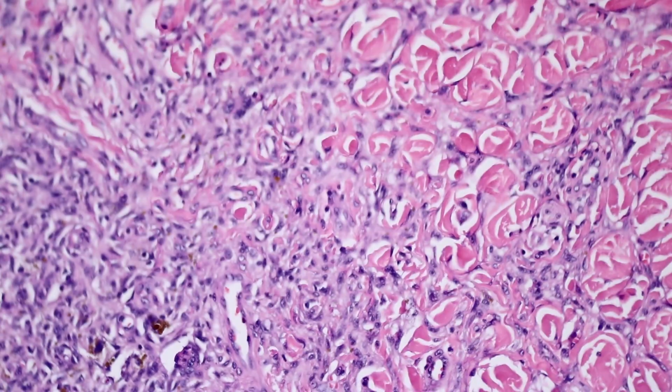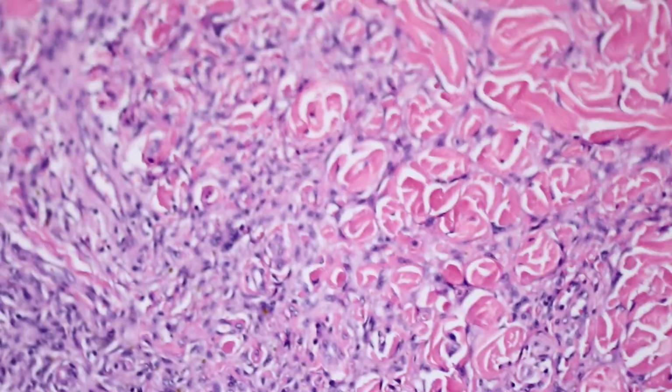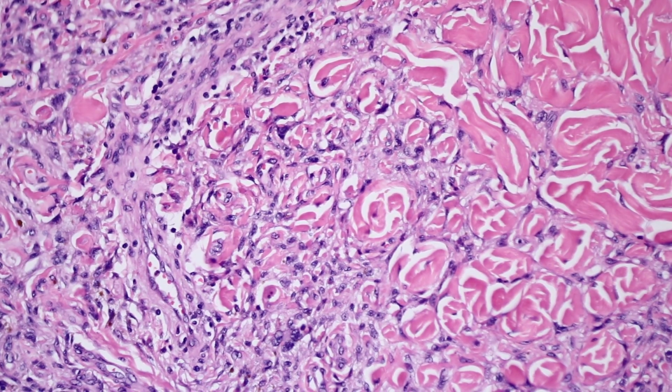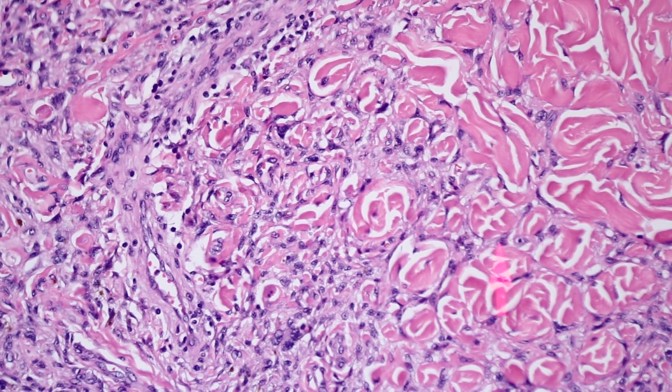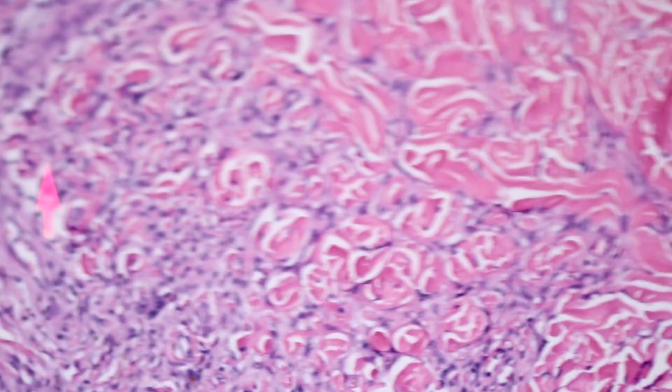You can also see some form of collagen trapping in dermatofibrosarcoma protuberans. It usually doesn't look quite like this, but you can see individual collagen bundles entrapped. So collagen trapping by itself is not totally specific, but I find that this kind of wrapping pattern is a pretty useful diagnostic feature for dermatofibroma, where you see the spindled and stellate or kind of plump cells swirling and wrapping around each individual chunk of collagen or each individual bundle of collagen here at the periphery of the tumor.